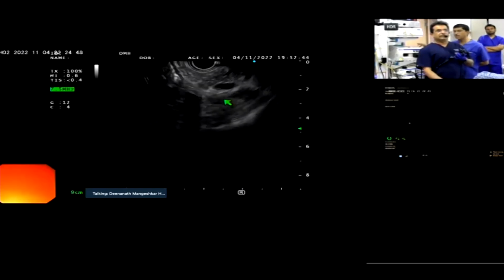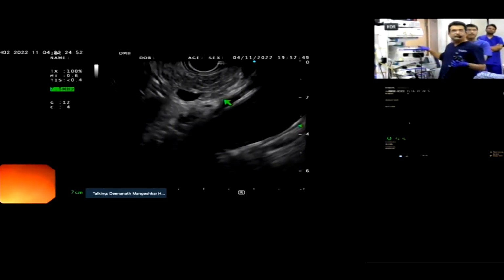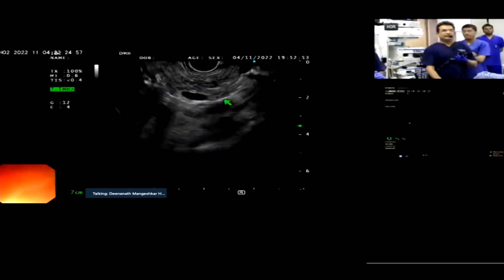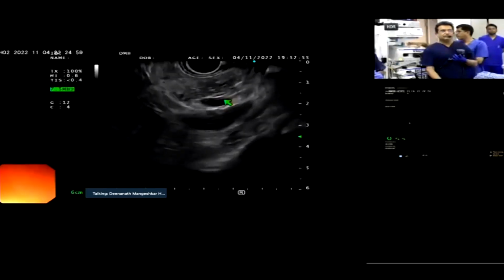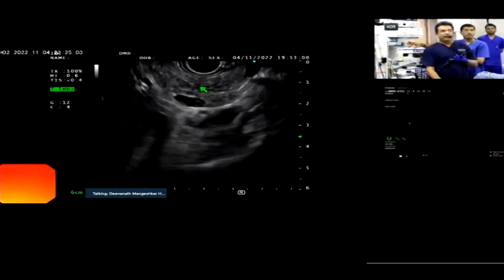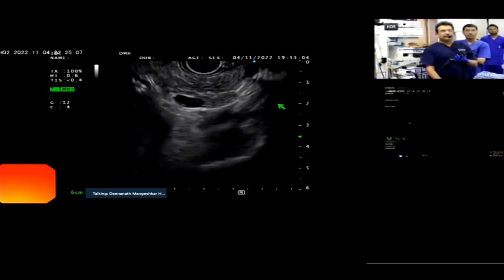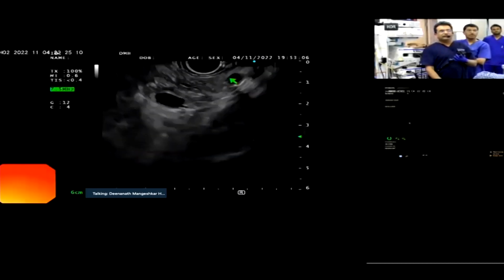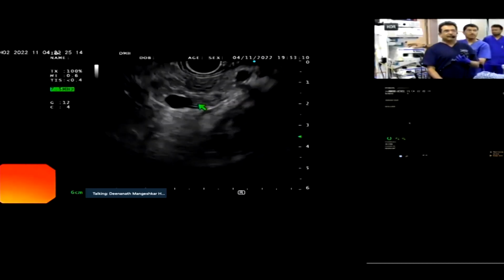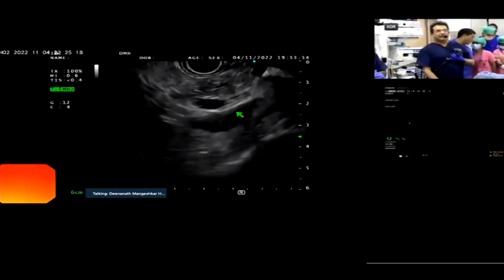He's an elderly gentleman, so his pancreas looks a little bit atrophic, so we'll just blow it up a little bit. And you can see the pancreatic duct in the center of the pancreatic tissue. Yes, sir. And you can see 2 black spots over there, which are vascular structures. The one at around 1 o'clock is the splenic artery, and the one at around 6 o'clock is the splenic vein. Now to trace the pancreas, first I trace it towards the tail.